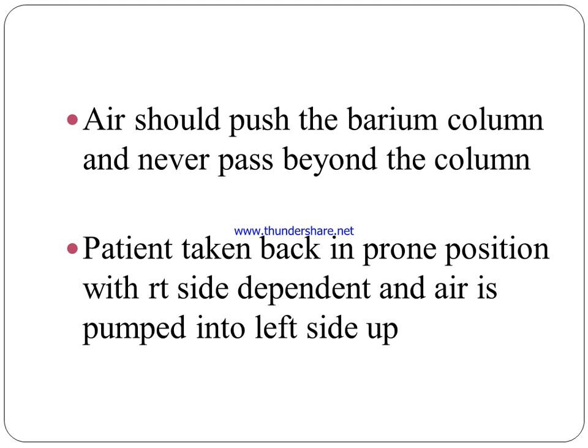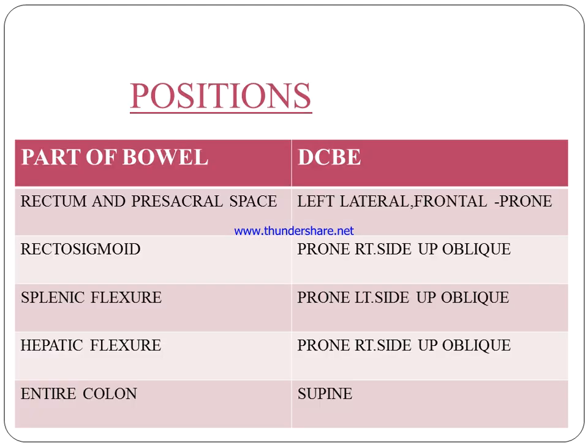Then the patient is taken back to the prone position with right side dependent, and air is pumped into the left side up position. For different positions: when we take an image of the rectum and presacral space, the patient should be in a left lateral or frontal prone position.